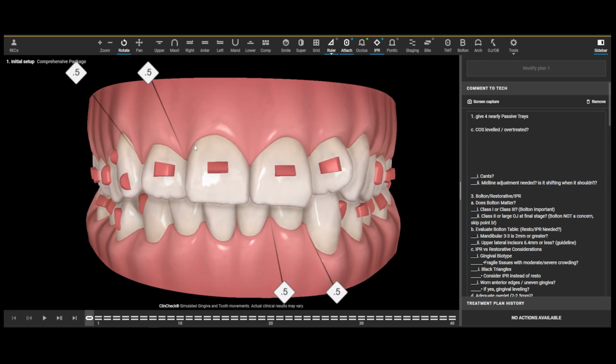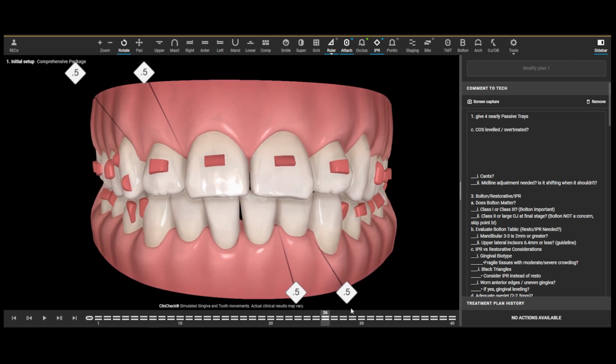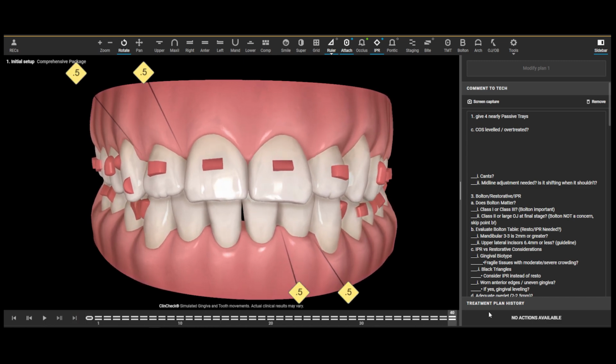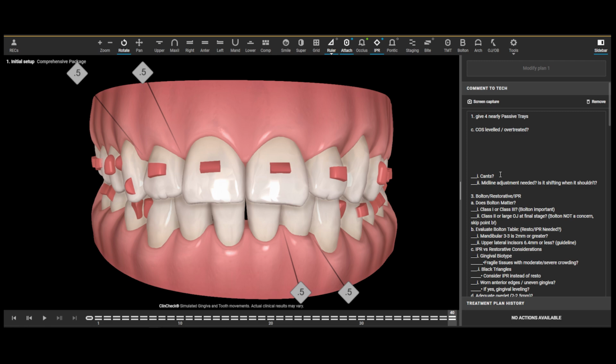Now, why is it moving to the patient's right? Well, because we actually planned some IPR. We asked the technicians to place IPR in quad 1 so that the midline would be able to shift into the space that we created when we do some IPR. We did a little bit of IPR on the lower, planned it at least, so we could move the midline on the lower over and have more coincidental midlines. So is a midline adjustment needed? Yes. Do we have it? Yeah. So thanks, Stephen from the past, for realizing this when we filled out the prescription form.